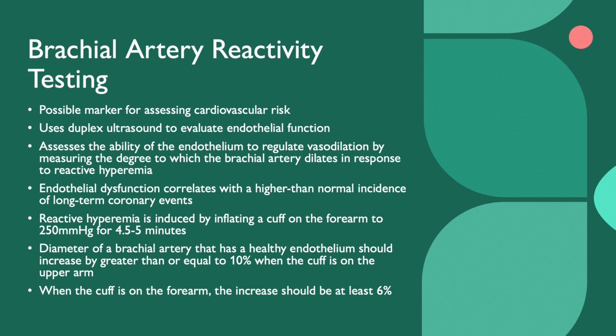So they're saying when you inflate that cuff, your artery should dilate. If it doesn't, that could indicate cardiovascular risk. Okay, I doubt anyone is using it, but you might see it. So if you do, let me know.